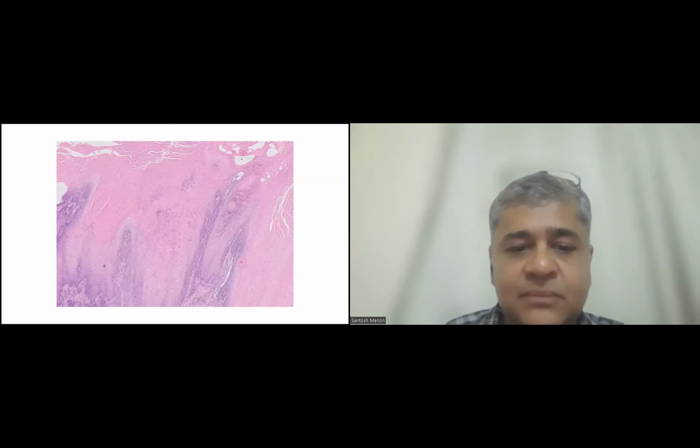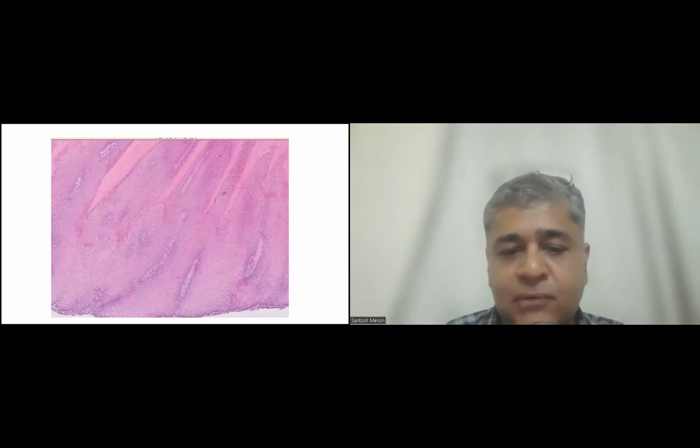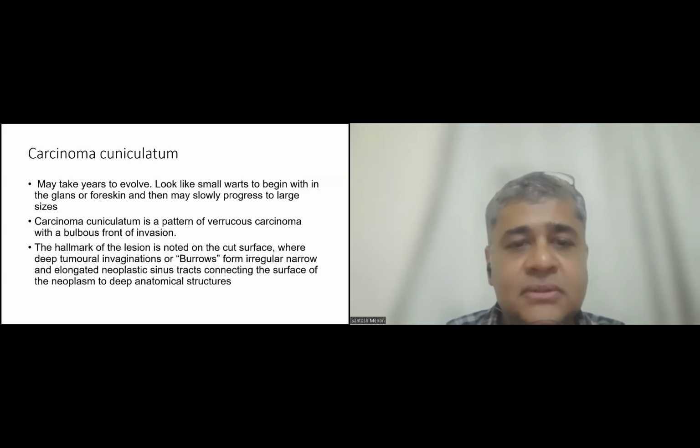Sometimes they may be associated with a small invasive focus, which is called a microinvasive focus of a verrucous carcinoma. You can see these tiers, and you can see the broad pushing fronts. Here is another picture showing these very broad-looking fronts with a lot of keratinization between them on the superficial aspect of these tumors. So it's important to note.